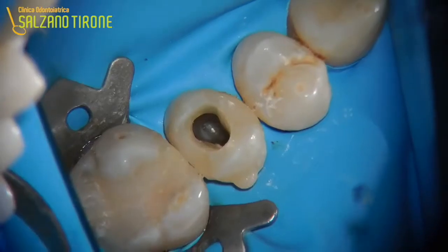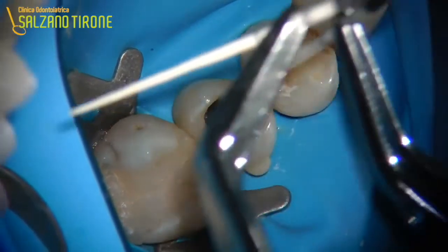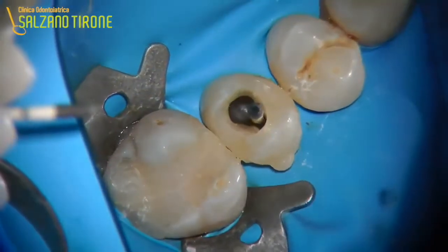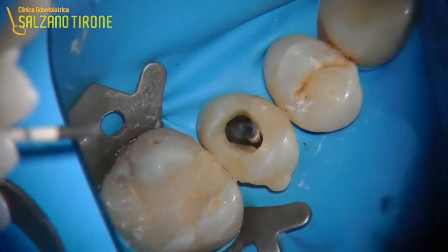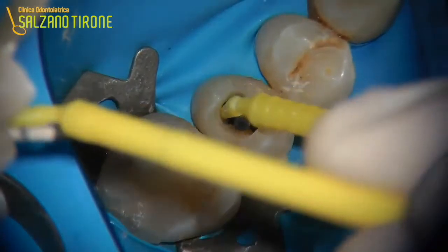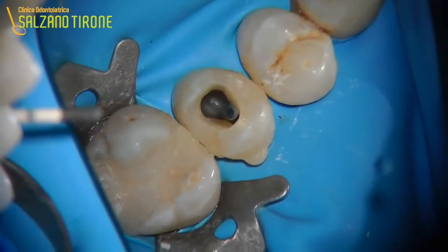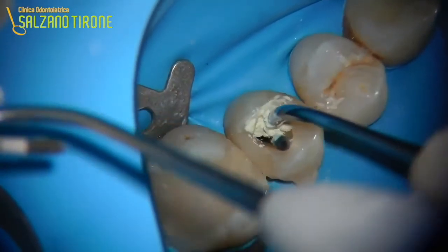I think that actually several methods can be used. For instance, in some cases I've used biodentin, as I mentioned in my post, but here I use the classic MTA. To prevent MTA from dripping into the root canal, I'm placing a paper cone in the main root canal, which was just one in this case, and I'm creating an ischemia with 36 volumes oxygenated water into the defect, as you can see right now, to prevent it from bleeding when I start placing the MTA. However, both MTA and biodentin are materials that can tolerate some bleeding and harden in wet environment.